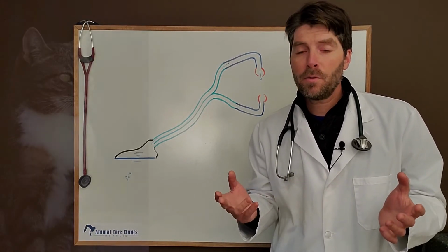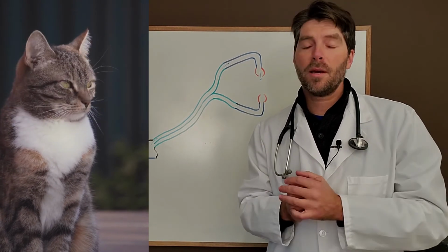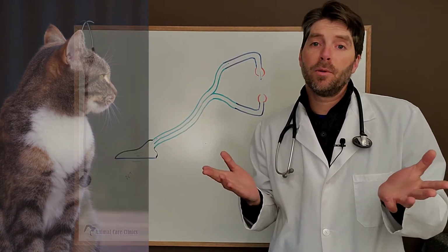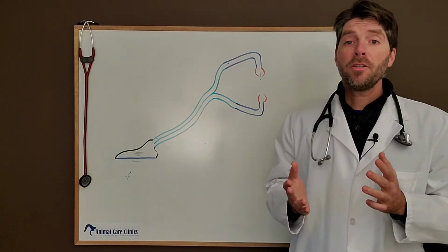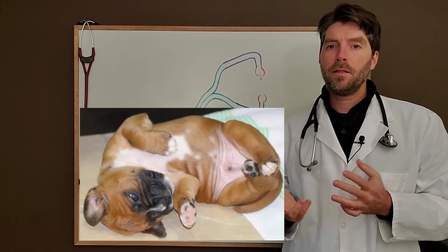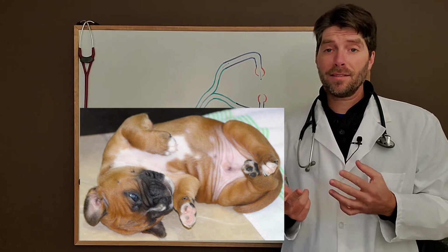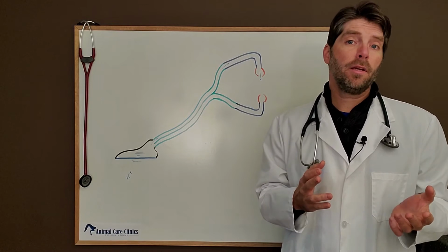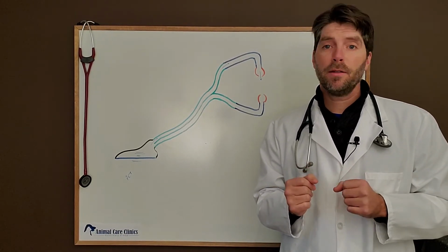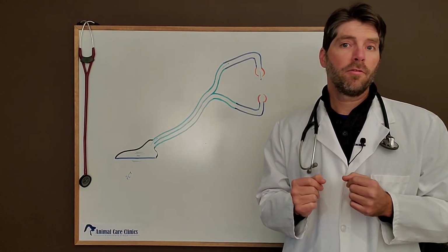Now, the exception to that are cats. As every cat owner knows, cats are special. They're always an exception. Sometimes with cats, we simply don't hear lung sounds, and that's considered normal. Go figure. Occasionally, we'll use the stethoscope to listen for other sounds as well. Sometimes we'll listen to the abdomen, especially to listen to the guts to see if they're all right, the intestines and such. And every now and then, we hear really weird things through the stethoscope. Sometimes we hear intestines in the chest. That's weird, and it's a really good reason to go looking for the cause.